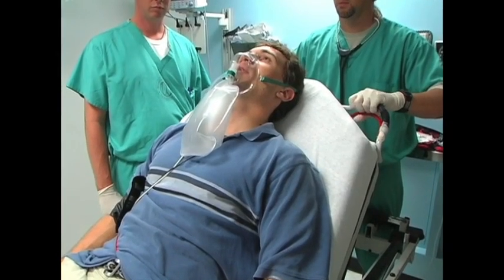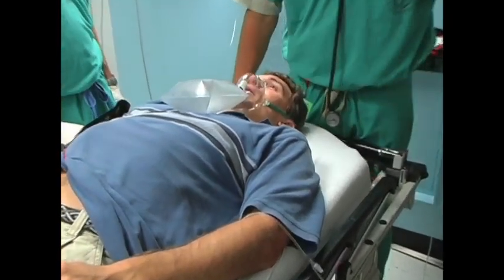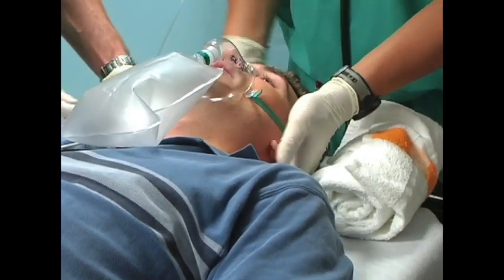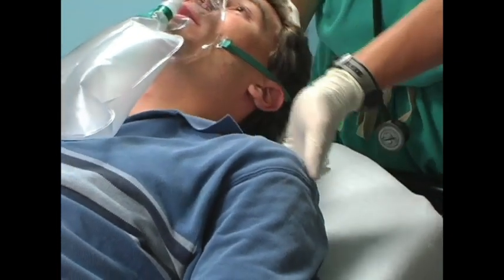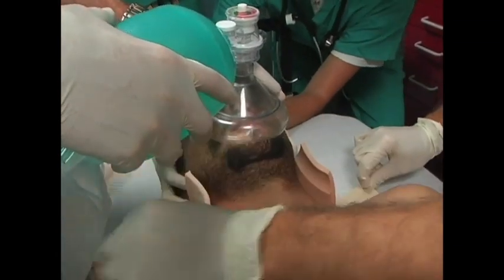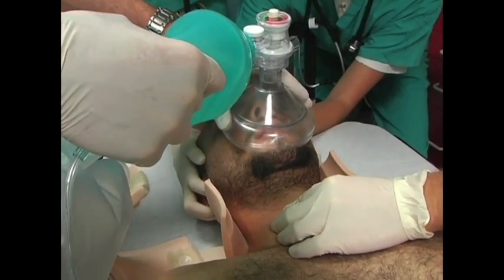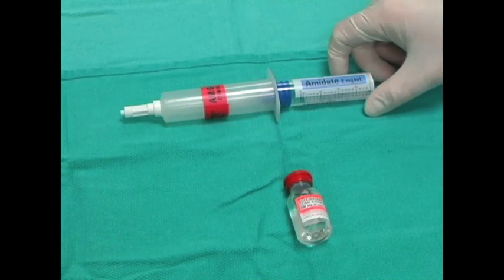The head of the bed should be lowered, and the patient should be positioned with the head extended and neck flexed, possibly using a roll towel underneath the occiput. If C-spine injury is suspected, the head and the neck should be maintained in a neutral position with an assistant performing inline stabilization.